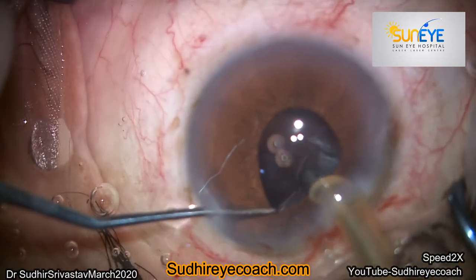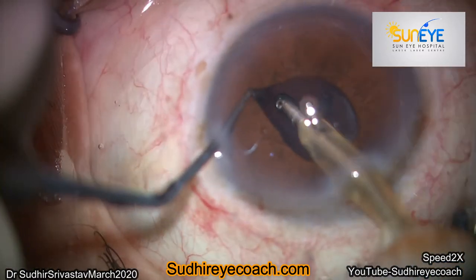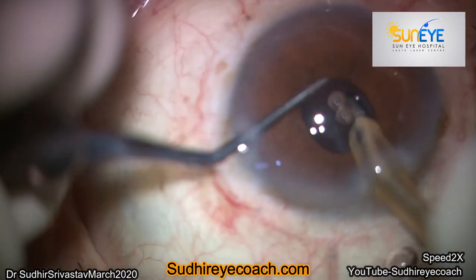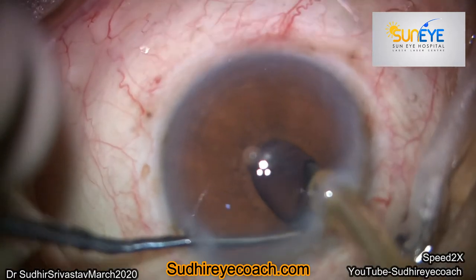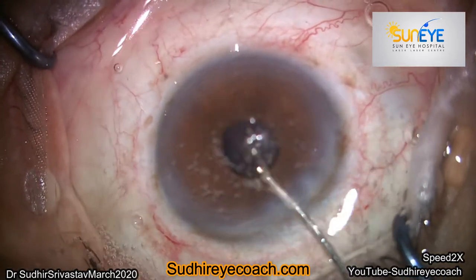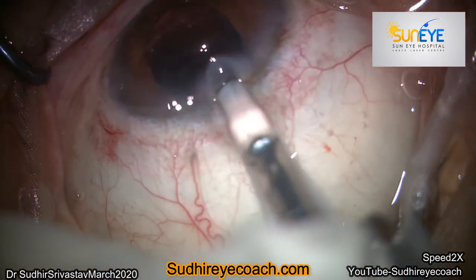So I hooked the iris at one point and then went underneath the rhexis, tried to catch the cortical tips, and tried to pull toward the center for cortical cleanup. This is a risky situation — whenever you are doing any manual maneuver, your instrument tip should always be under visualization. I used intracameral mydriatics for dilation and used viscoelastic to dilate the pupil.